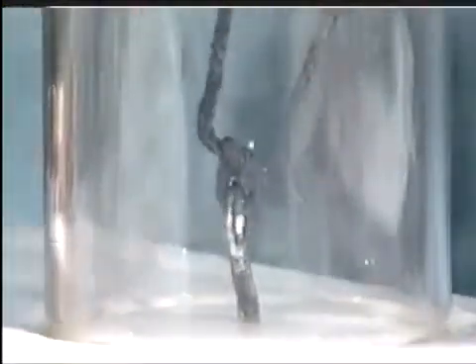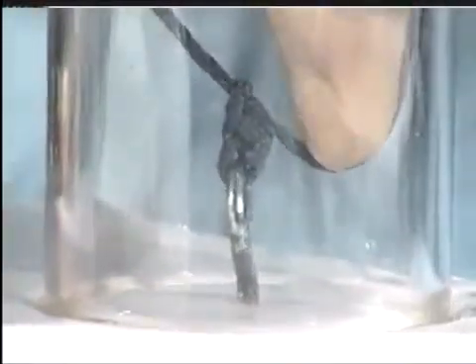Withdraw out into the open and you are in a position to tie your first throw. Snug it down, taking the index finger beyond the vessel and tighten it without putting any pressure on the screw itself. Do a second throw and snug it down again, being careful not to exert any pressure on the screw. You may then want to do a third throw for security, again snugging it down. Then cut the suture material as appropriate.